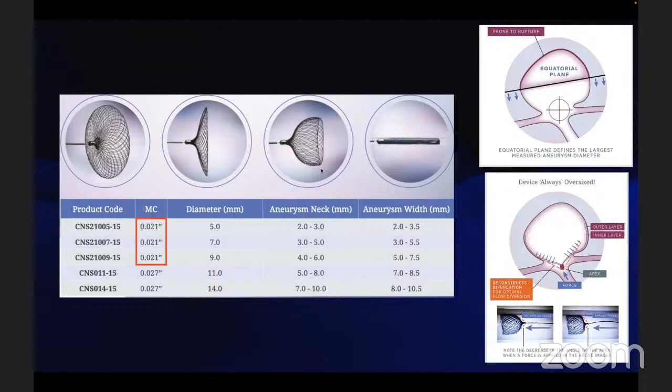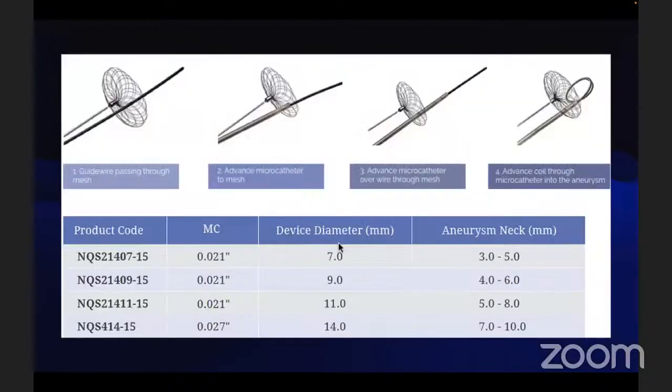This is about the contour, and in the next slide, this is almost the same neck stent as you told, and we have to keep the coils in this particular neck stent device, because it is not a dense mesh, so it allows the blood to enter into the aneurysm. So we have to place the coils in this device. Next.